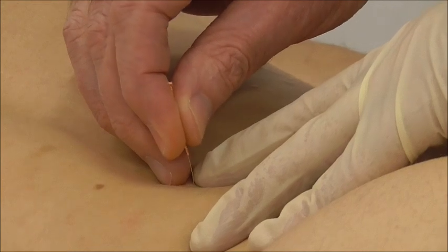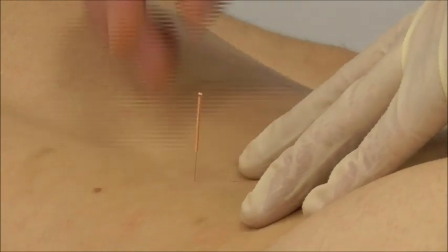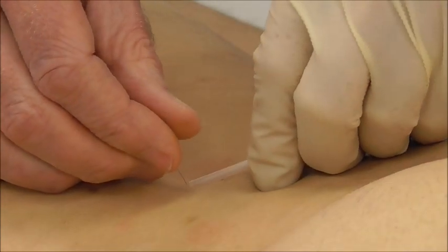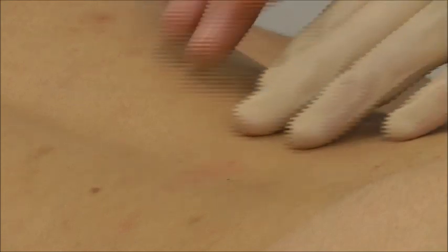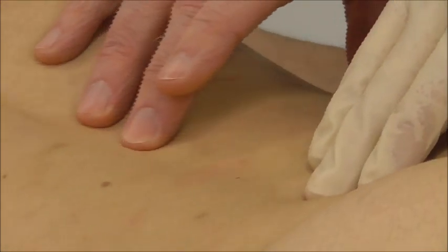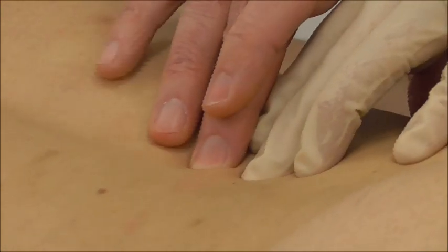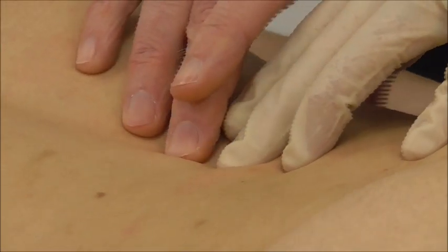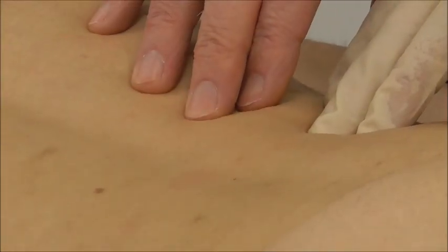Once done, I withdraw the needle and press the skin down. We need to put dry needling into context — it may be that I wanted to do some manual therapy first and dry needling second, or vice versa. Either way, I'm using dry needling as part of my manual therapy treatment toolbox.